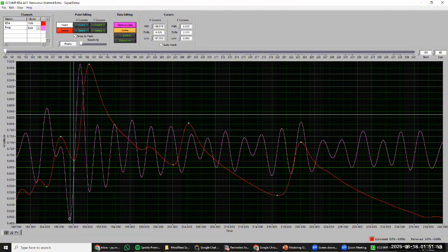And here's our other X cursor on the onset of that respiration. By placing the two at those locations, the delta point for the X cursors is the absolute time between them. And remember, if there's going to be a skin conductance response, it's usually about a 1 to 3 second latency. So if I were to take a breath at this point, about 187 seconds in, then 1 to 3 seconds later, if there is an SCR, it could be correlated to that respiration.